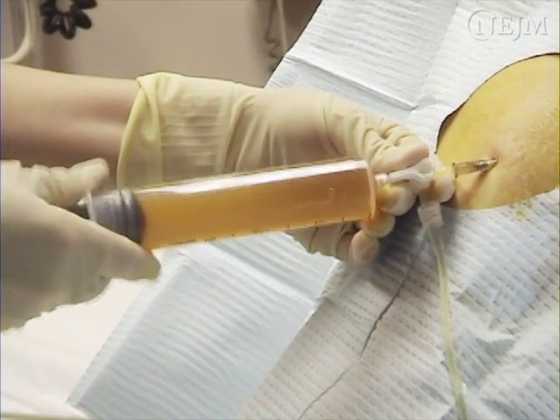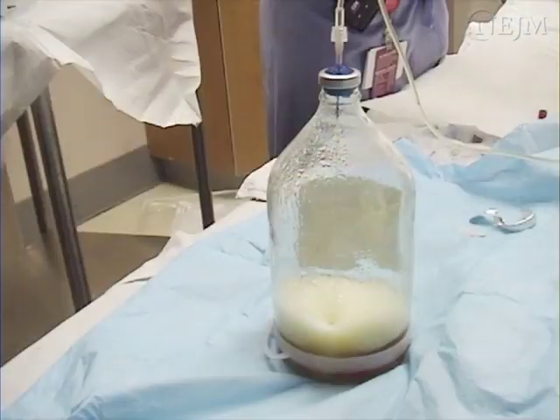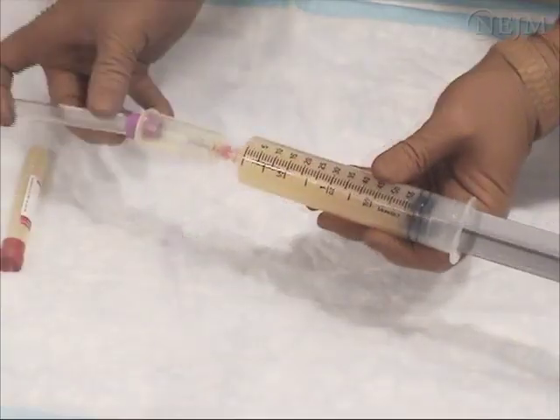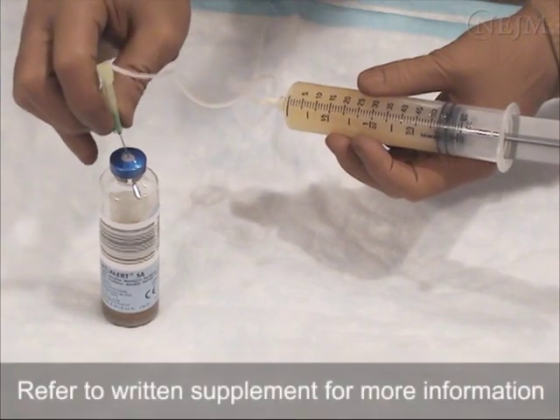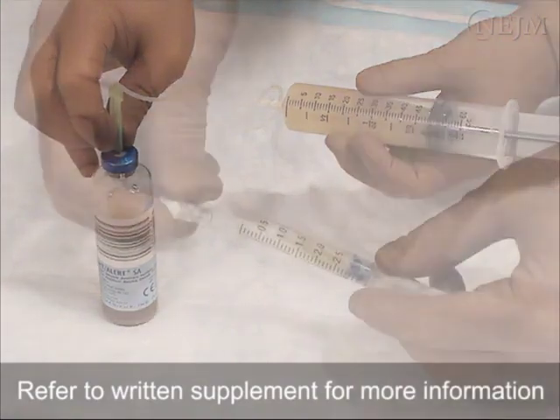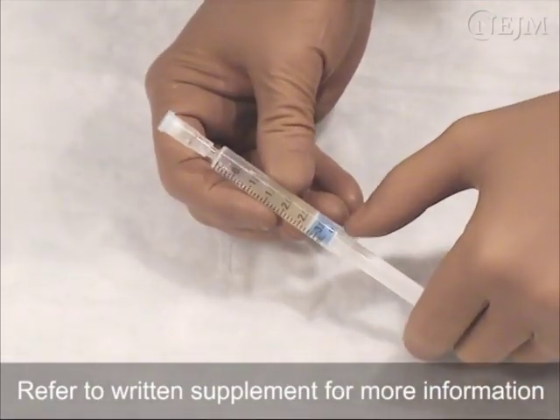Aspirated fluid should be placed in specimen tubes before the large evacuated container is filled or while it is filling. One tube should be used for chemical analyses such as the measurement of lactic dehydrogenase, protein, and glucose levels. An EDTA-treated tube should be used for the cell count and differential count. Specimens for cytologic and microbiologic analyses and for other tests may be required depending on the clinical circumstances. These are discussed in further detail in the accompanying written supplement.